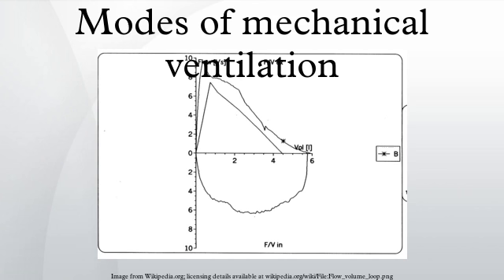The exhalation time is shortened to usually less than 1 second to maintain alveoli inflation. In the basic sense, this is a continuous pressure with a brief release. APRV is currently the most efficient conventional mode for lung protective ventilation. Different perceptions of this mode may exist around the globe.